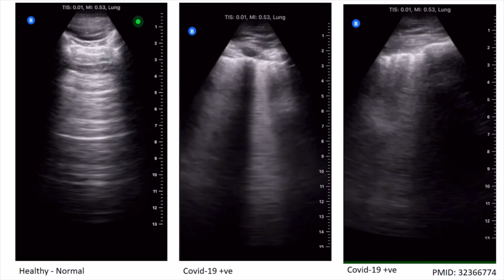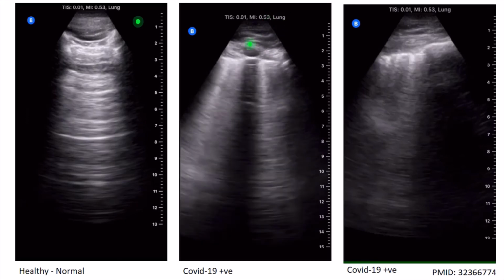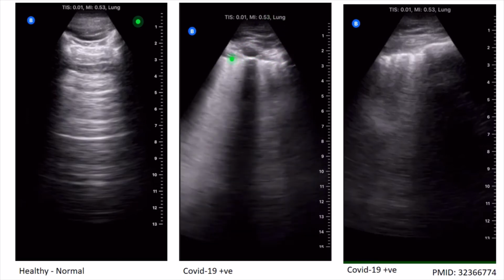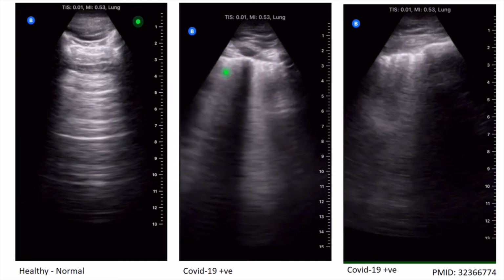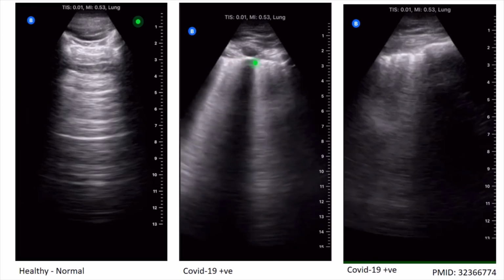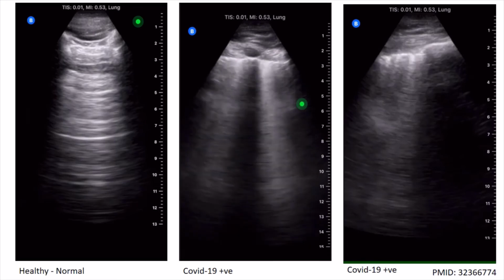This is a lung ultrasound study in a patient with confirmed COVID-19 infection. We're in a lung preset. We see a rib here with a shadow, and an adjacent rib here. This is the pleural line, and we can see that it's thickened and irregular. There are B lines, confluent B lines here, an isolated B line emerging under this interspace, and some pleural thickening at the affected areas with some adjacent normal pleura and A lines.